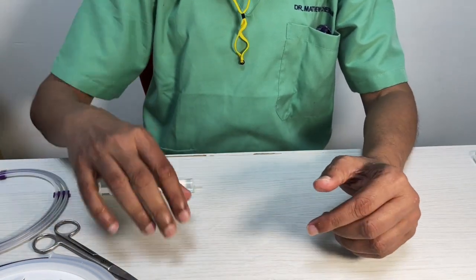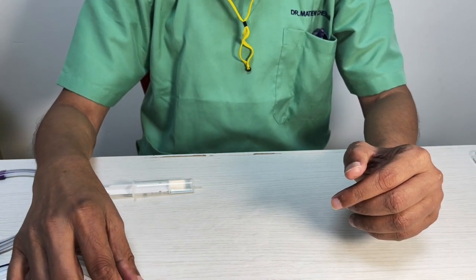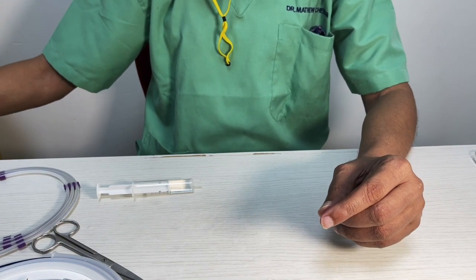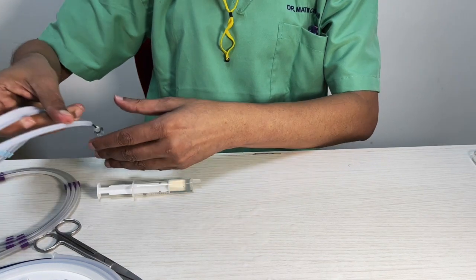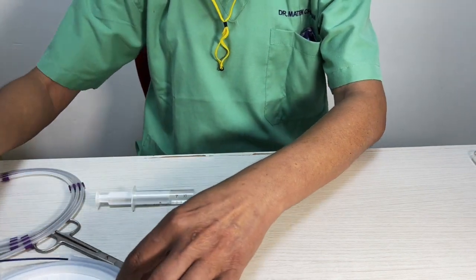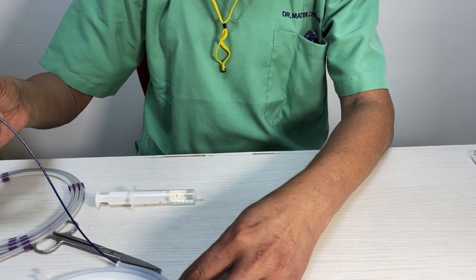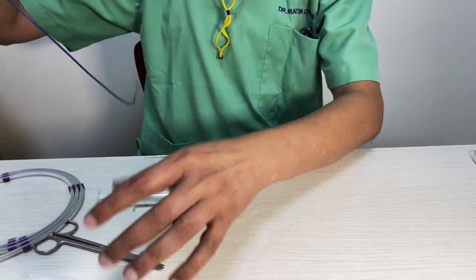Now, the other distal access catheter that you have is the Cat 5. Now, where do you position Cat 5? I just want to show you a Cat 5. So this is a Cat 6. I think this is a Cat 5. Okay. Now, this is a Cat 5. Cat basically means catalyst.